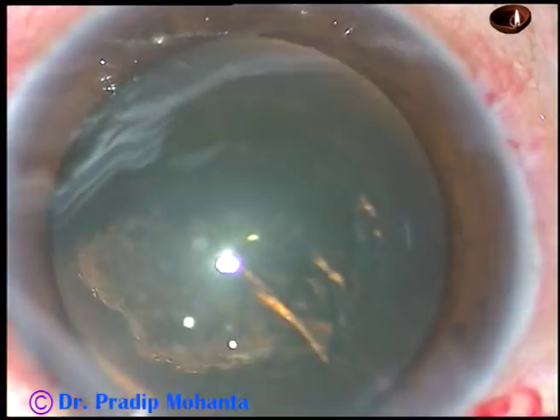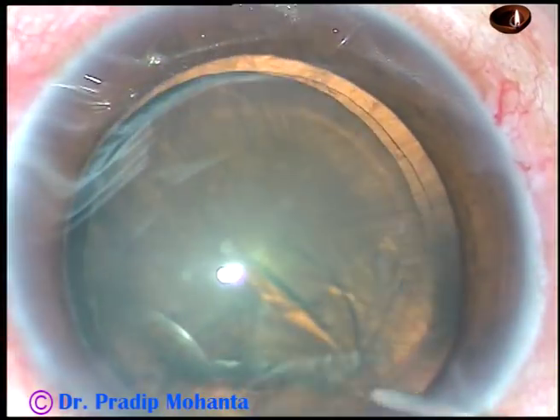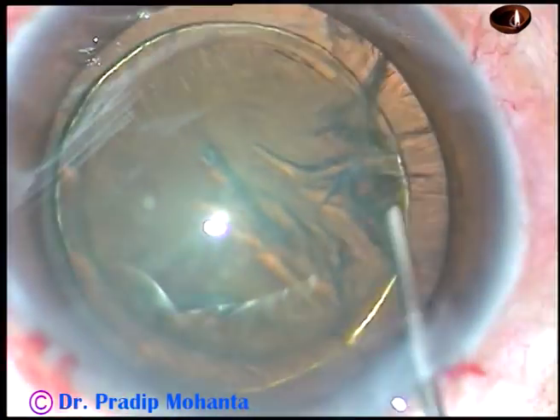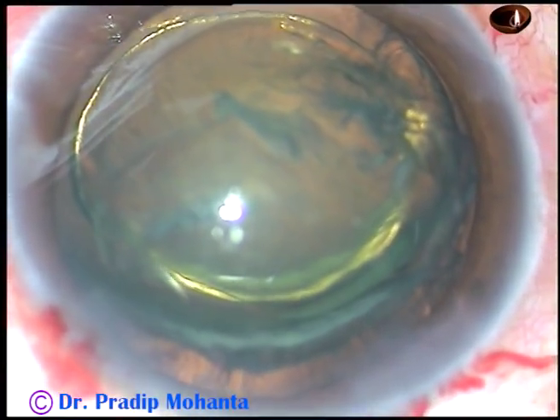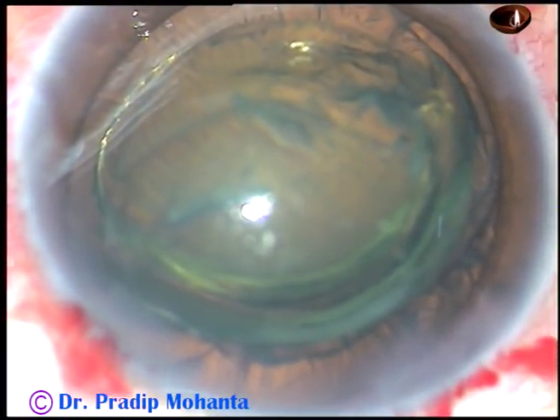And now hydrodissection. BSS is passed just under the anterior capsular rim and it goes to the opposite equator. Hydrodelineation is also done. Hydrodelineation has produced a beautiful golden ring in this case, and some more hydro has prolapsed the equator out of the capsular bag.